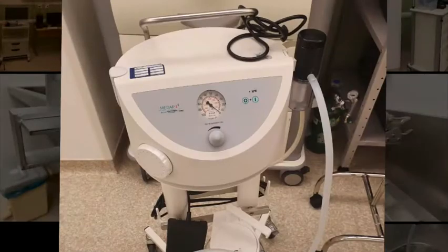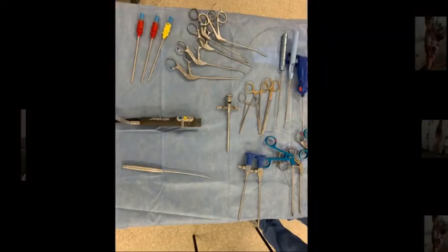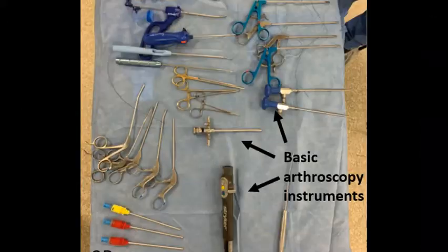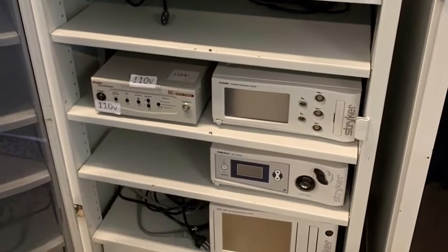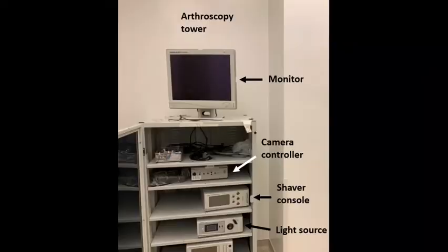A vacuum cleaner is also extremely necessary. The arthroscopy table must be assembled with arthroscopy forceps, blades and shaver handpiece, scalpels, and meniscus scissors. The arthroscopy tower must be equipped with a video monitor, light source, a camera controller, and a shaver console.